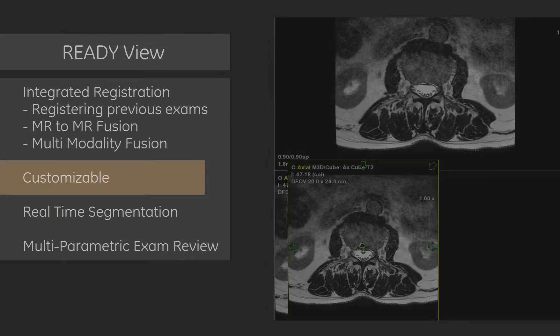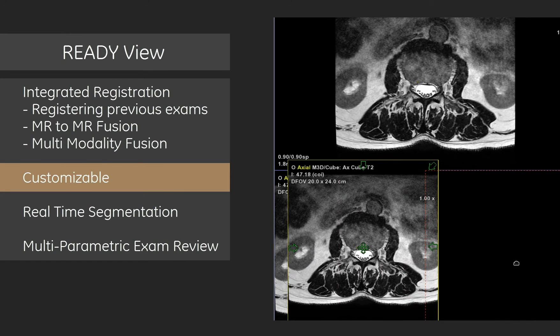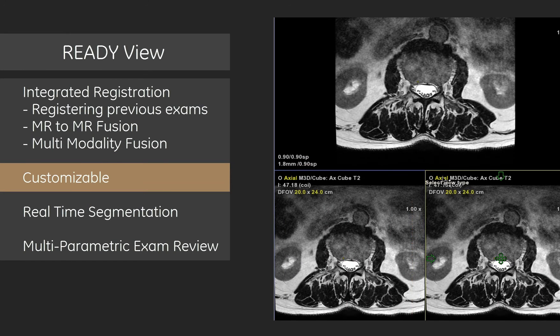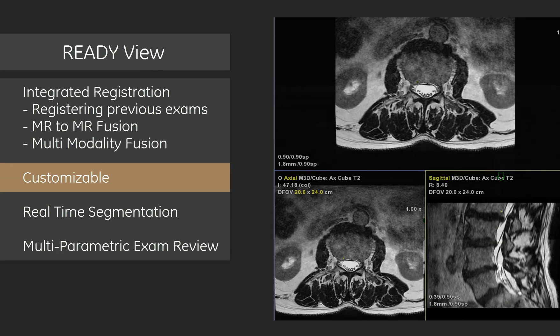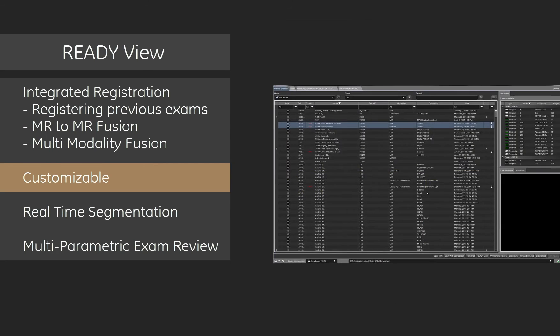Customization allows you to view data in a familiar way with custom screen layouts, saved protocols, and review steps.